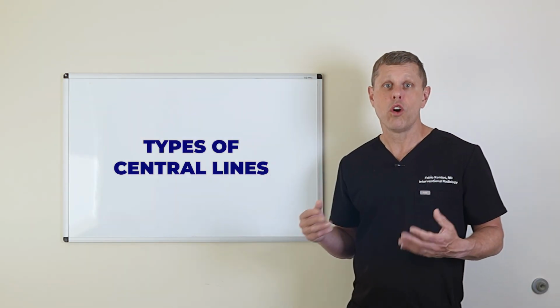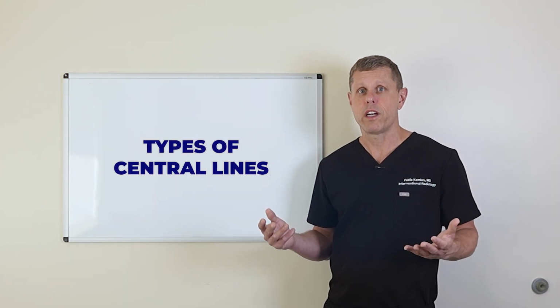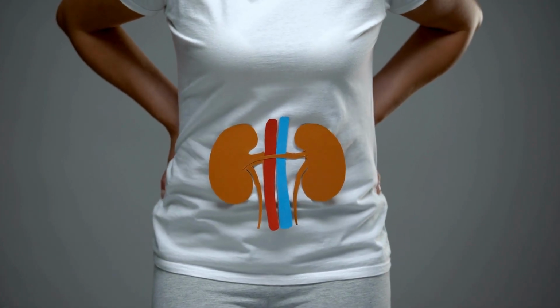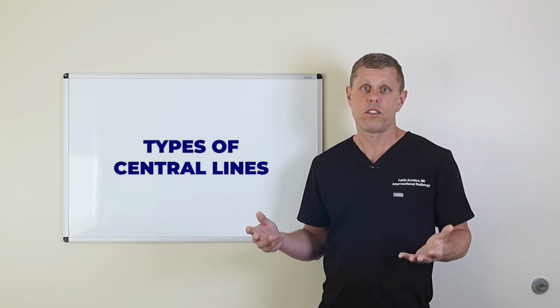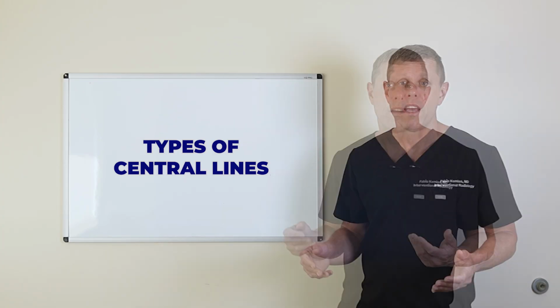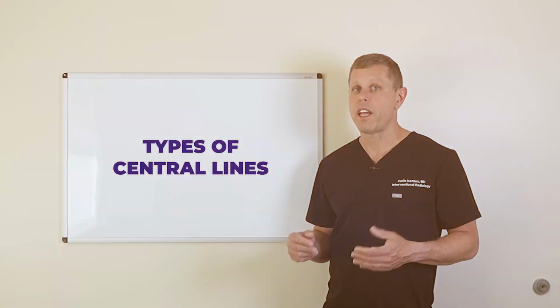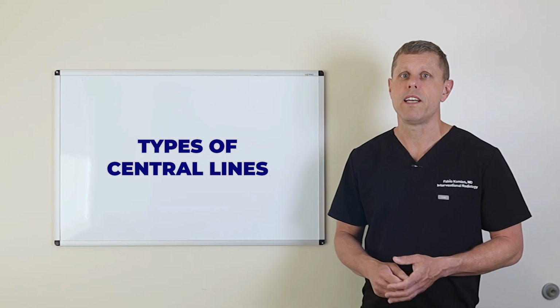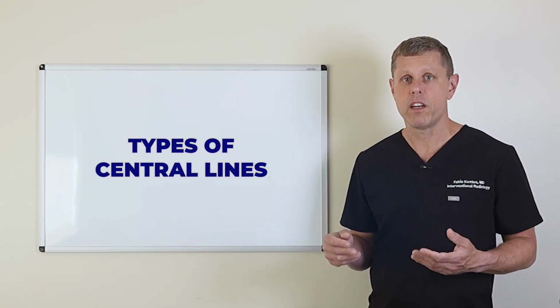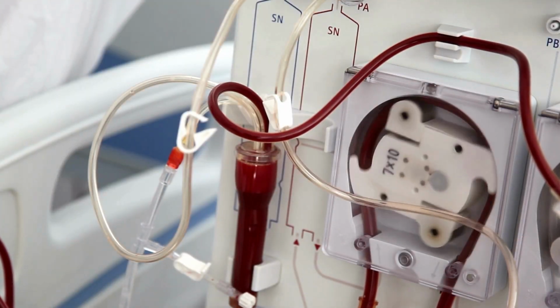We use non-tunneled central lines for patients who also need emergency dialysis, for example, patients that are in acute renal failure and need to be dialyzed right away. Those are the simpler lines to put in, and they can be put in in 5 minutes at the bedside, usually again through the internal jugular vein or through the femoral vein. They are a little bigger than the standard central lines that are used for IV medications, for example, because you need a lot of flow coming out of the body to run through the machines to get the blood cleared.